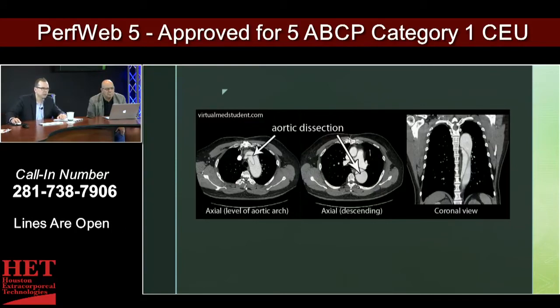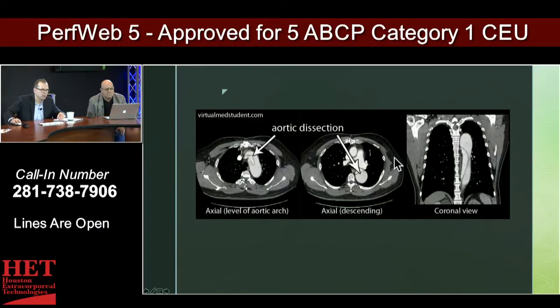This is a different view. You have axial views, sagittal views which go side to side left to right, and then coronal views which cut the body from front to back. This shows the true lumen and then the false lumen of this same dissection. What's neat about this picture is you can see the intimal flap within the arch of the aorta.